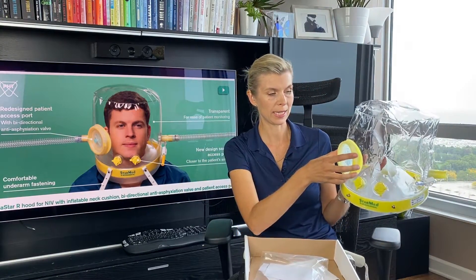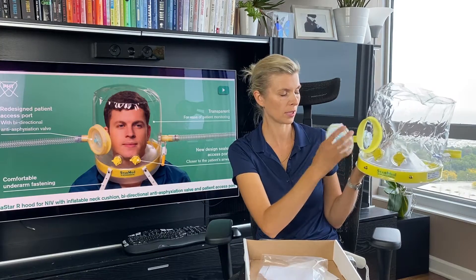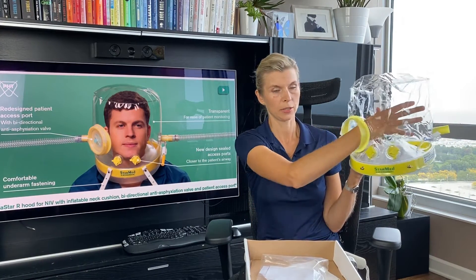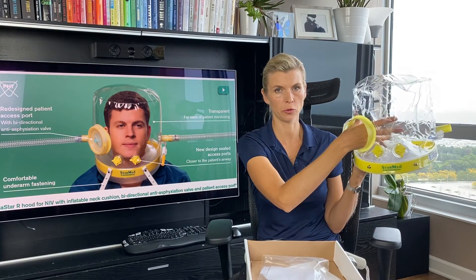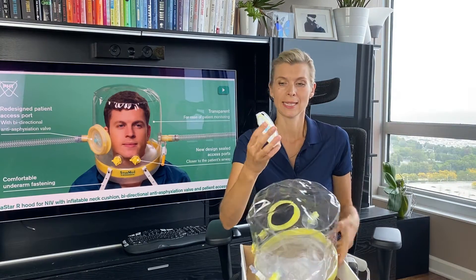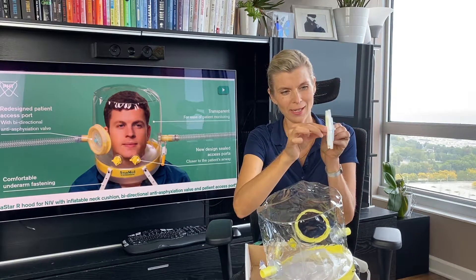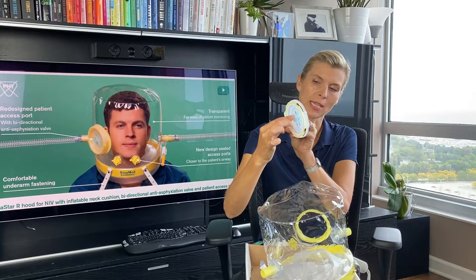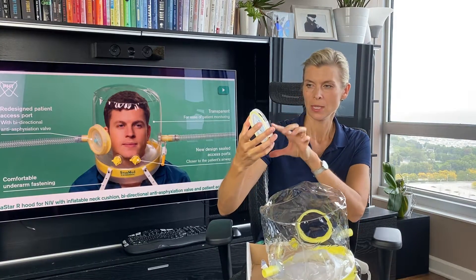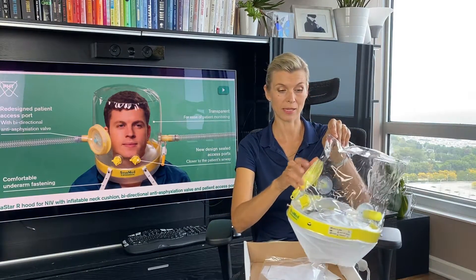Another great feature for this helmet is the anti-asphyxiation valve. This part is the patient access port — you have a big patient access port that you can fit your arm through easily. If you need to do any patient care, you can do that without taking the helmet off. It has a spring, so when the flow reduces in the helmet, it opens up at two centimeters of water pressure. It's a nice safety feature.